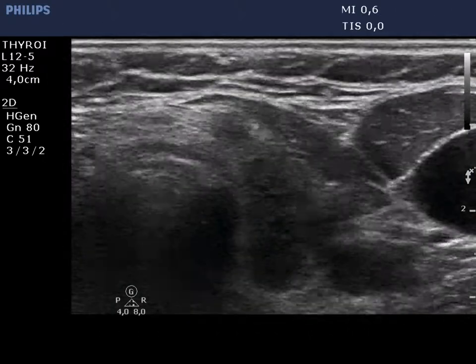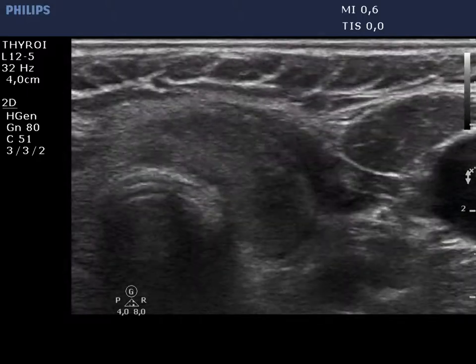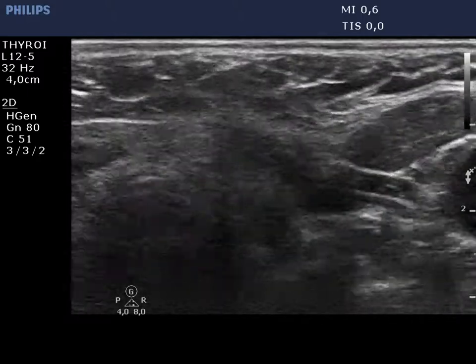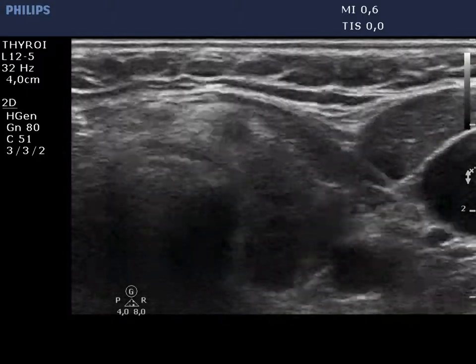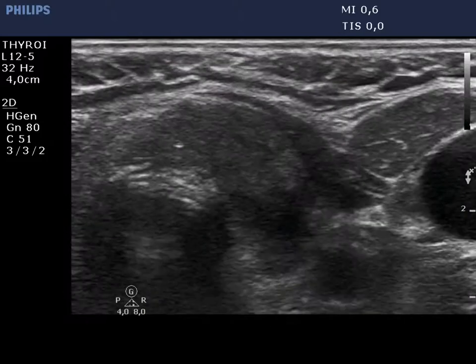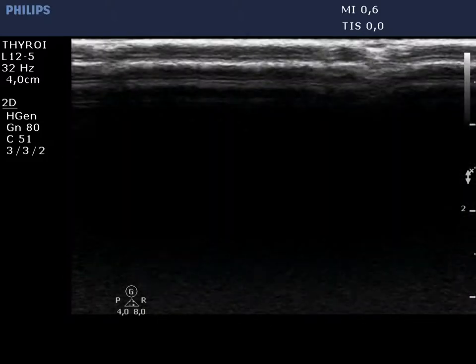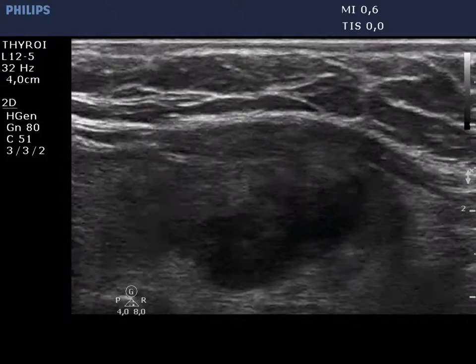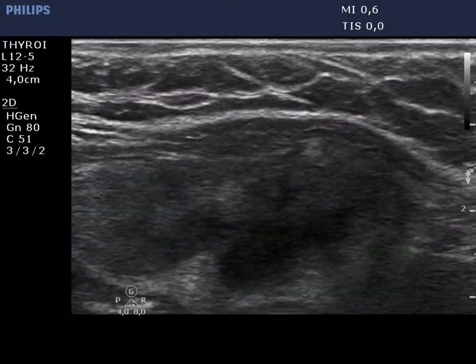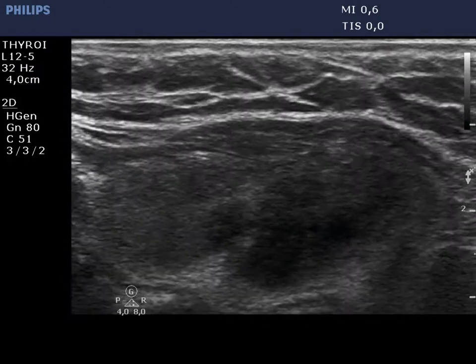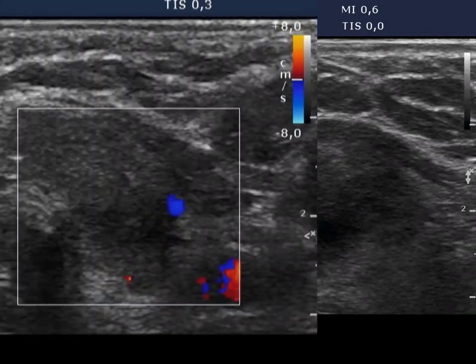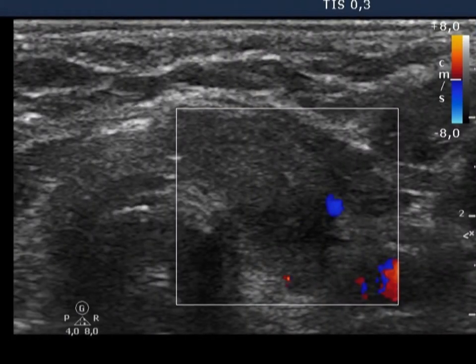There are more hypoechoic areas in the left lobe with the typical ill-defined borders. According to the hypoechoic lesion, there is no vascularization on the Doppler mode.